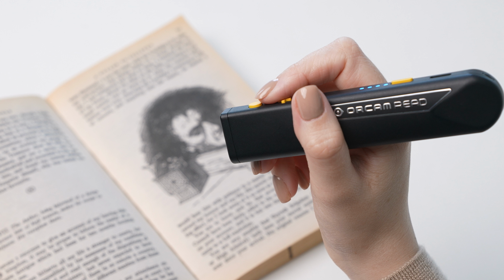To start reading from a specific word, say, "Hey OrCam, start from," and the device will find that word in a block of text and start reading from it.